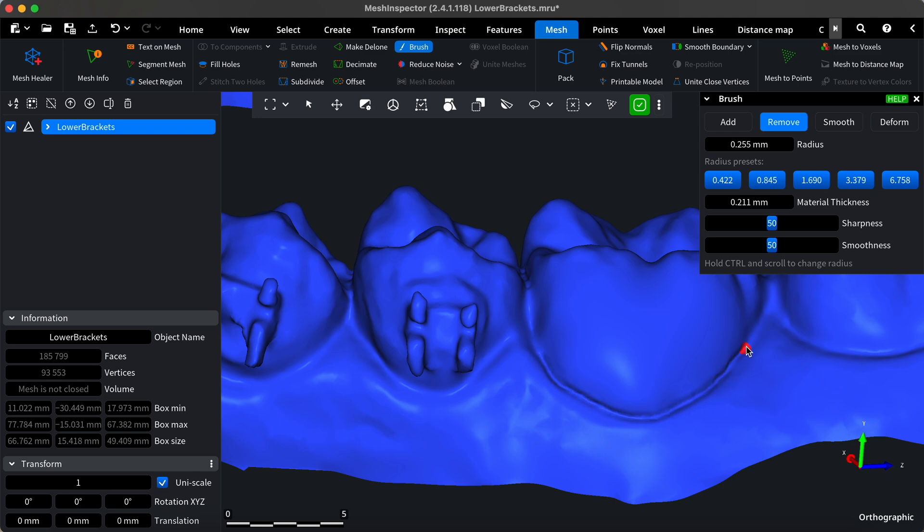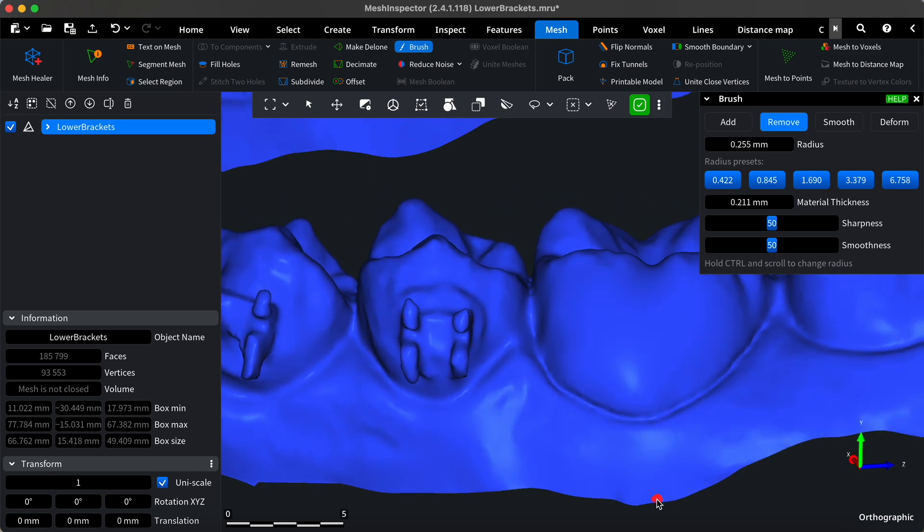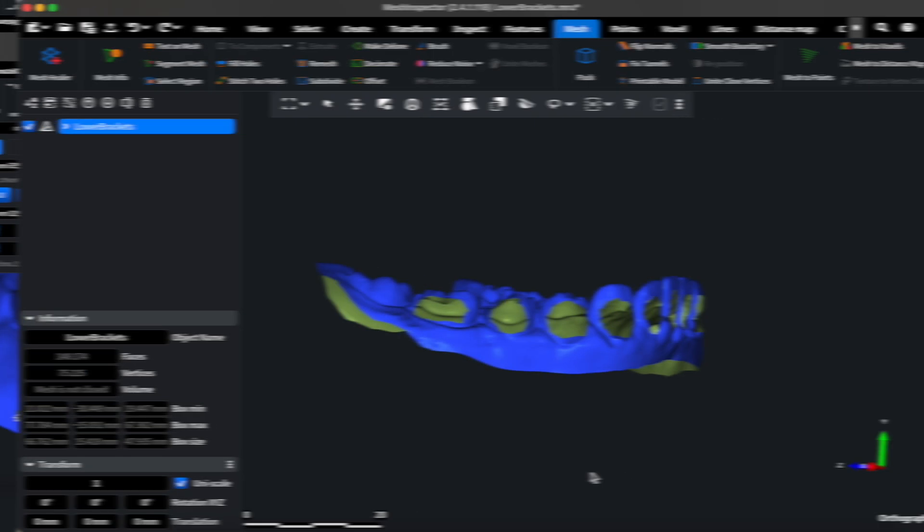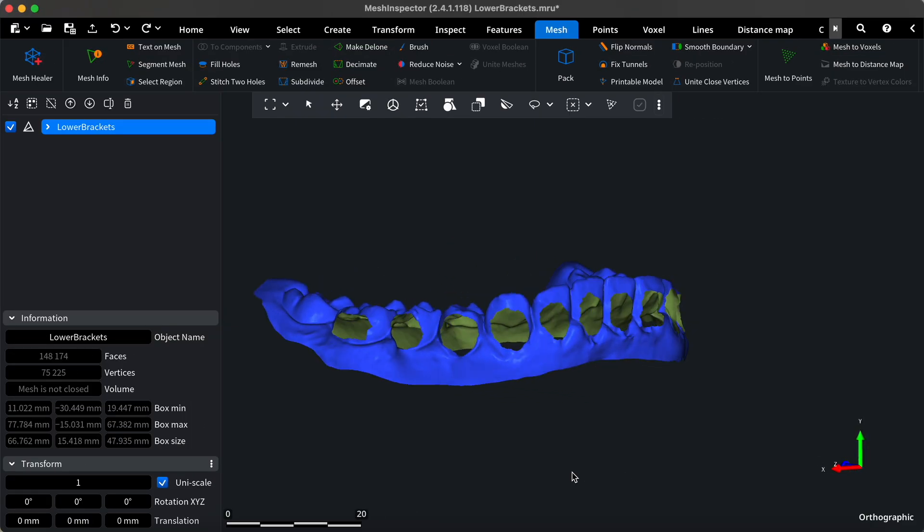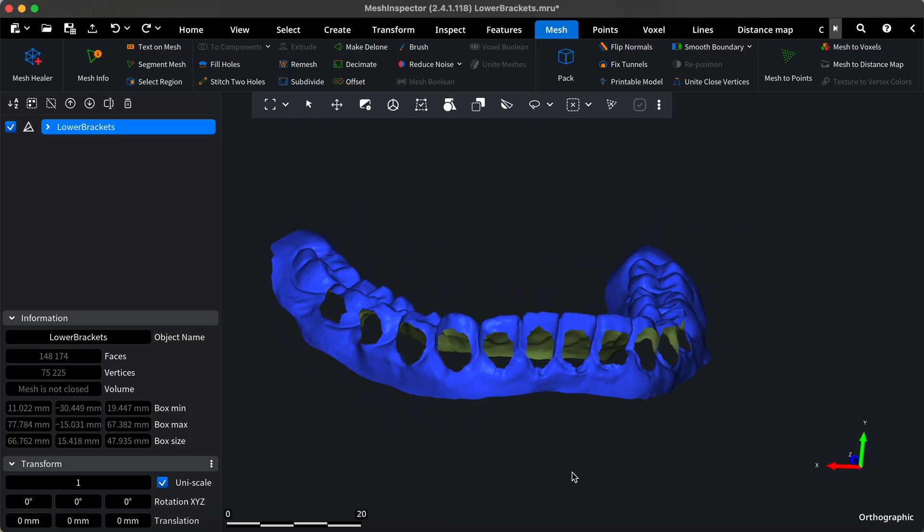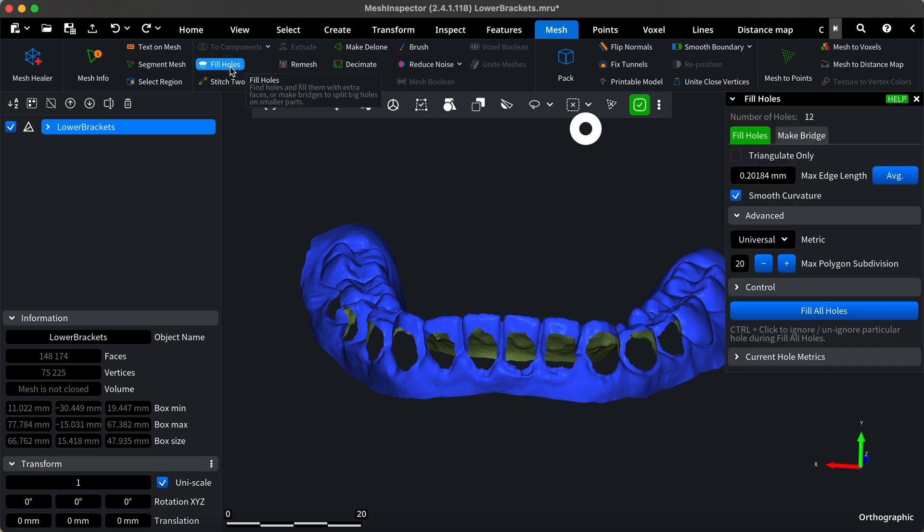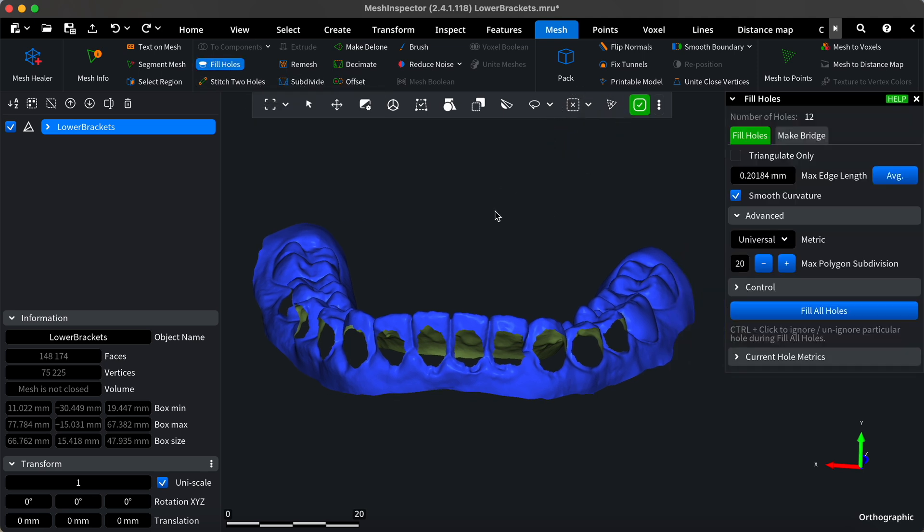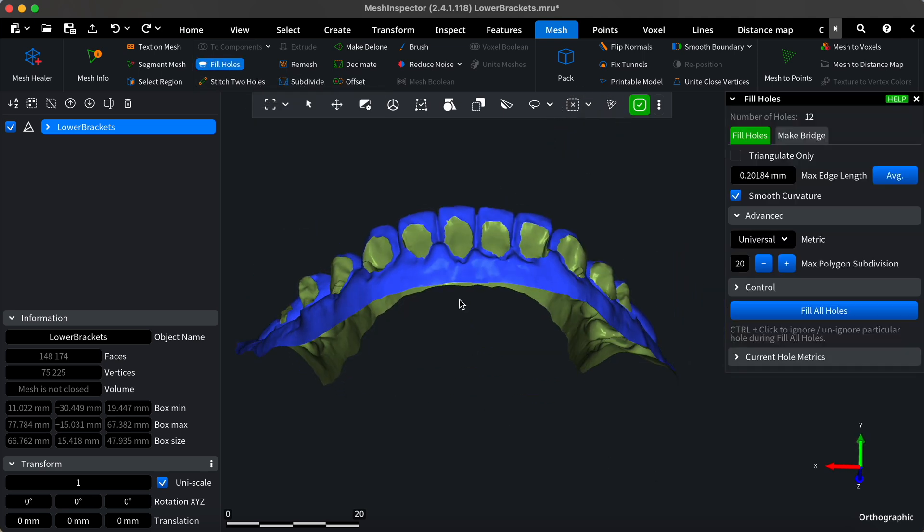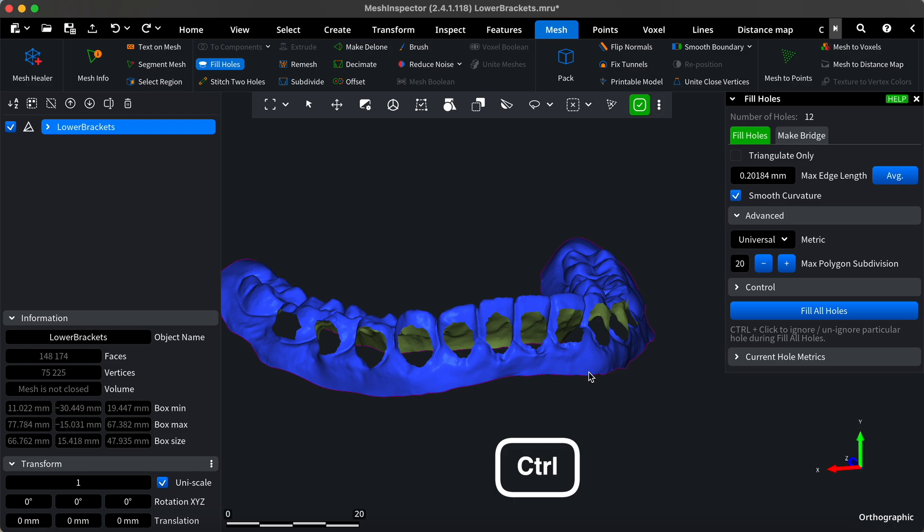The result looks great, and I'm satisfied with it. Let's move on! You can fill holes and smooth them in bulk when you finish removing the brackets. To do this, use the fill holes tool. But first, omit the bottom hole by clicking on it while holding the control button.